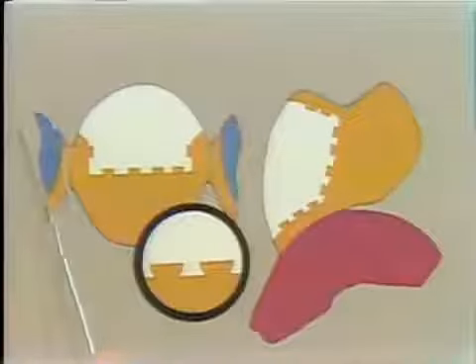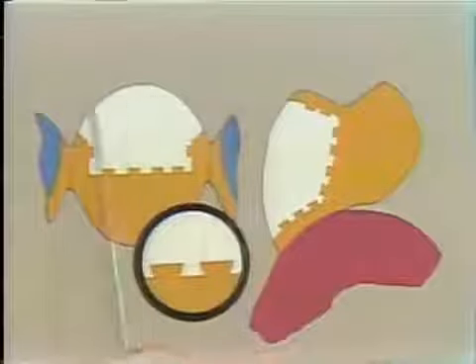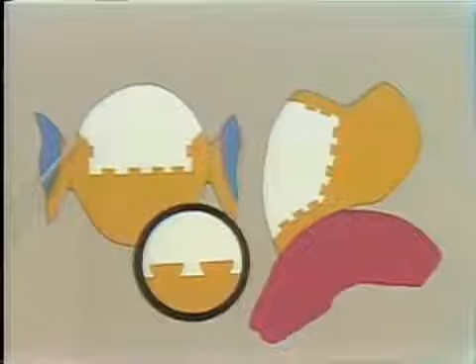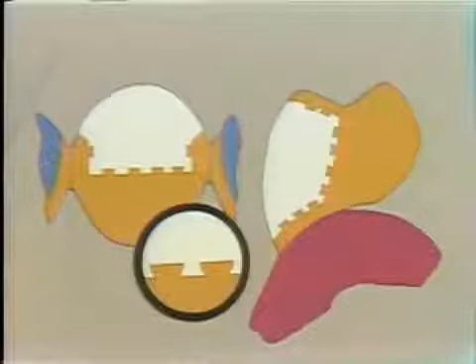If we take a look at this part of the diagram, which is a cross-section through one of these Pontics parallel to the occlusal plane, the point which should be noticed here is the development of the window for the resin in this region here. It has to be extended sufficiently far to the buccal to enable a solid joint or cast connector to be put in here without interfering with the facing. It needs to be tucked sufficiently into the interproximal space here that the gold is not visible in the normal view of the Pontic, so that maximum aesthetics are maintained.